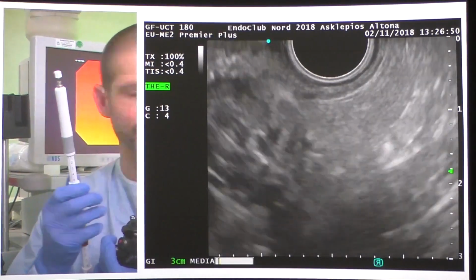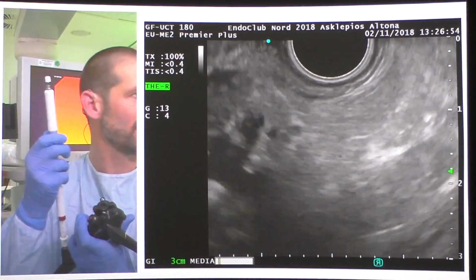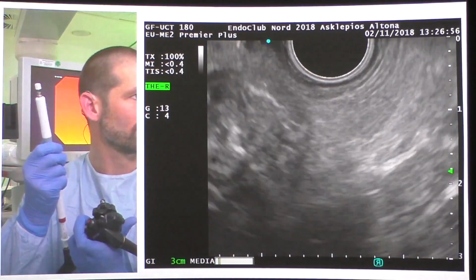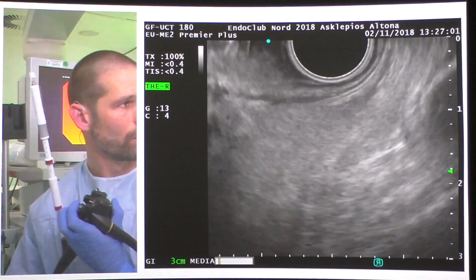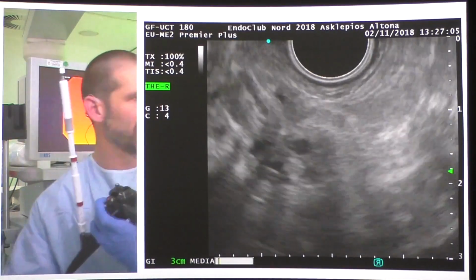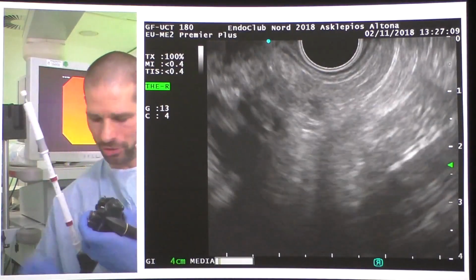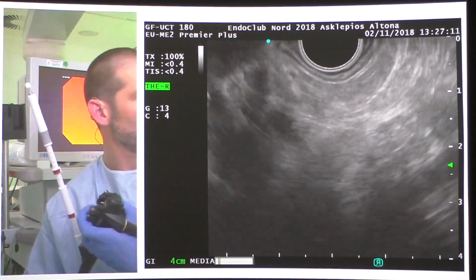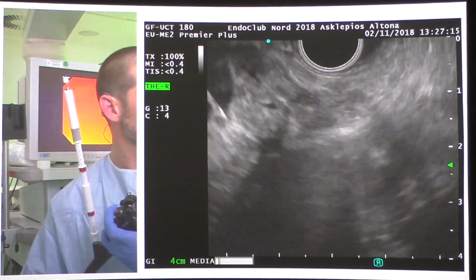Well, we have limited control because of the breathing of the patient. It's not us shaking, it's the patient moving because of her breathing. Well, the problem is that with the variability of her breathing, I have a difficulty to set the scope properly.